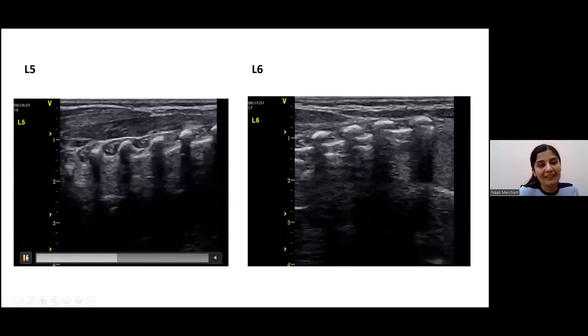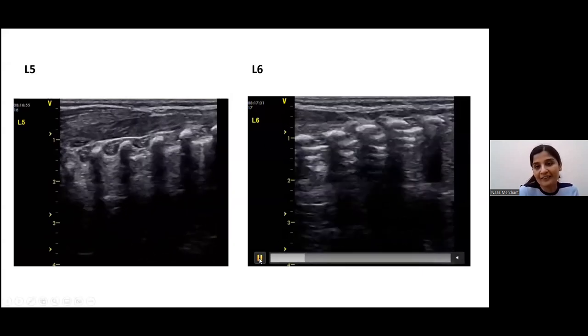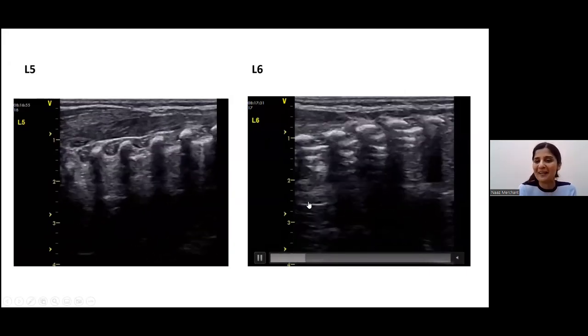And then at the back as well on the left side, obviously we flipped the baby over, so it's a little bit more dense over here, but still you can see good pleural sliding, and there are A profiles essentially over there. And then lower down as well, again, interestingly, seems to be better, lots of A lines essentially coming up over there.